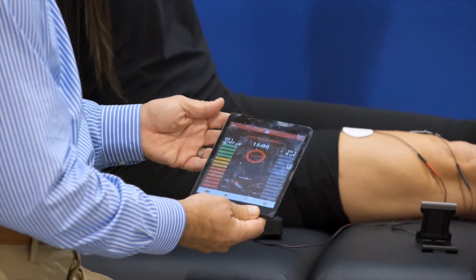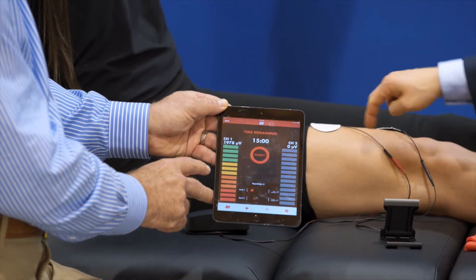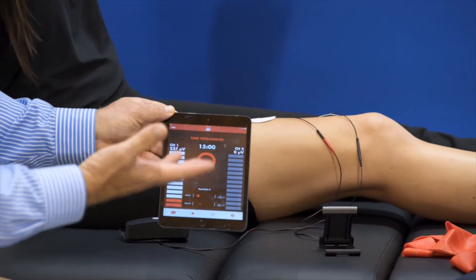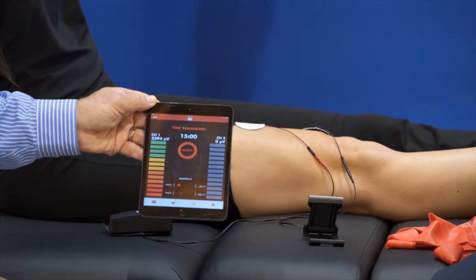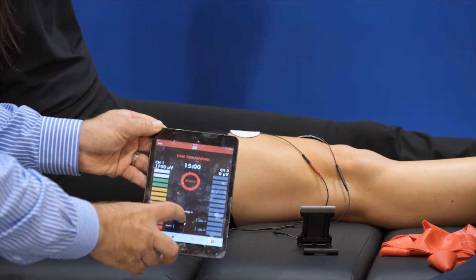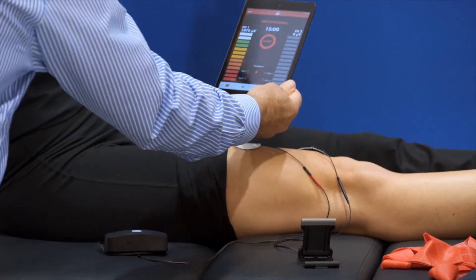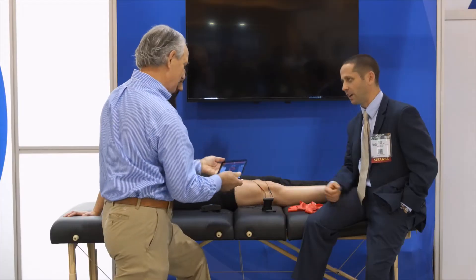Tighten your muscle up, squeeze really hard — you see she's got a really good contraction. Now relax it. We set the on and off time to 10 seconds on, 10 seconds off and we cycle that back and forth over a 10-minute period. Tighten up again, squeeze hard — now we're going to make it harder and she's got to make a harder contraction to keep that up there. So that's her threshold.